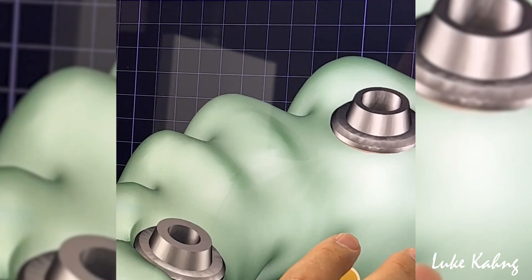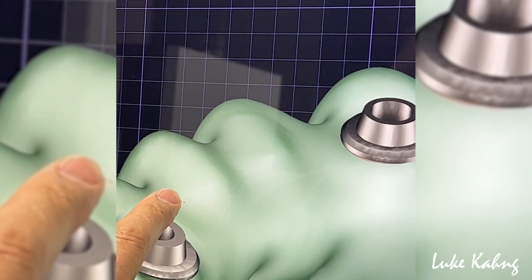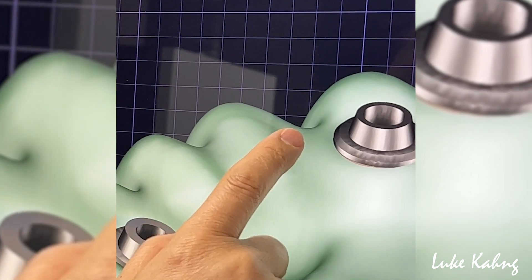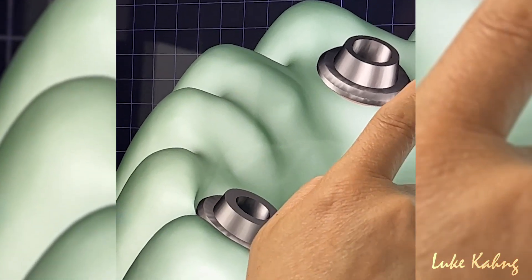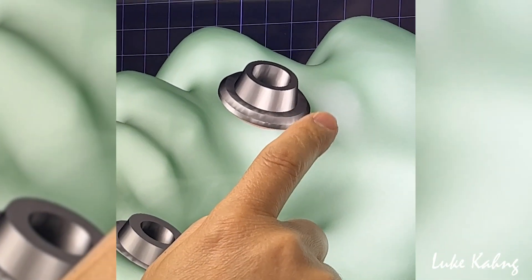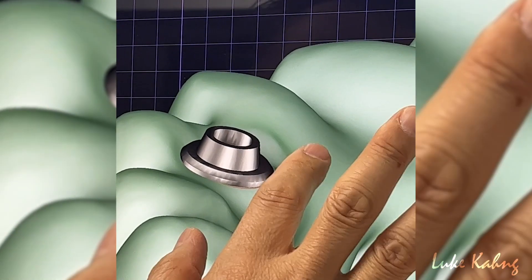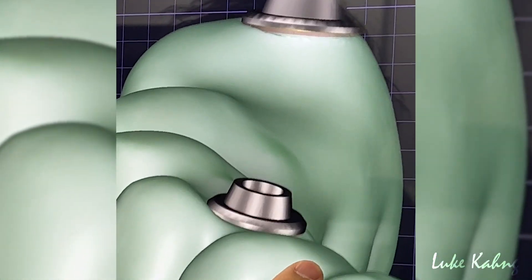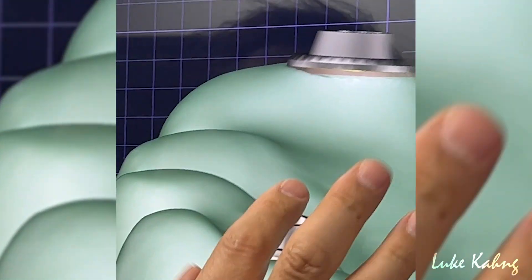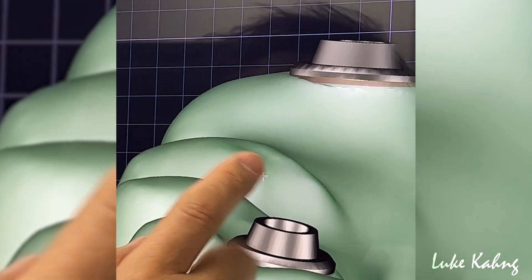So make the good football shape and contour. Our tissue is no problem, and the doctor and I are on the same page. That's pretty good.